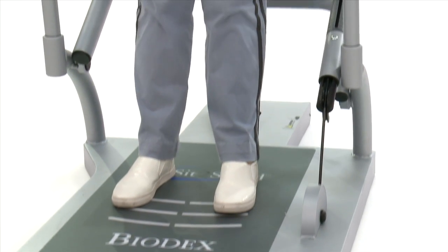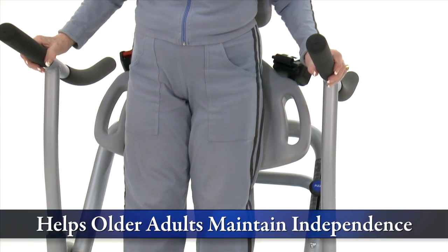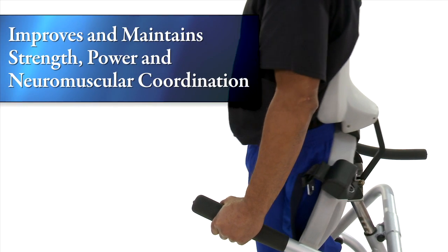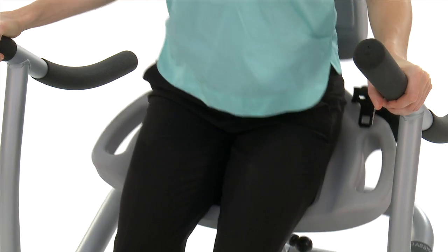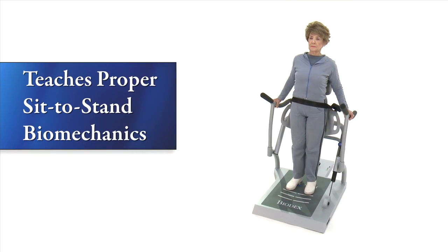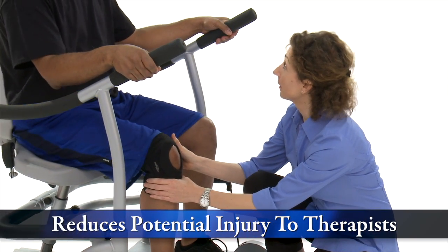Exercise using the Biodex sit-to-stand trainer helps older adults maintain their independence. It increases range of motion, improves and maintains strength, power, and neuromuscular coordination, provides an opportunity for gentle and safe plyometric activity, teaches proper sit-to-stand biomechanics, and reduces potential injury to therapists.